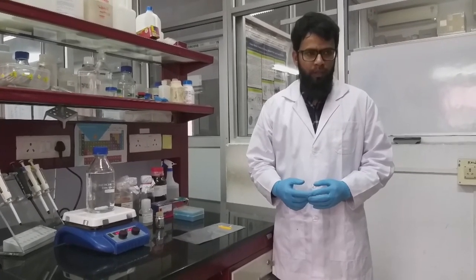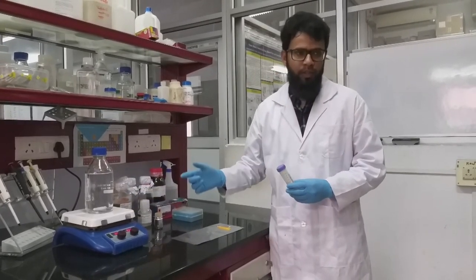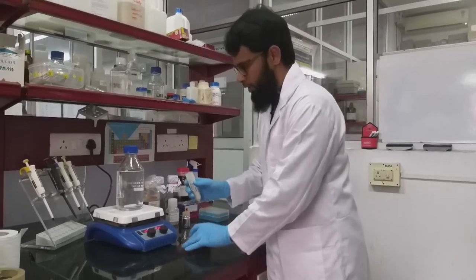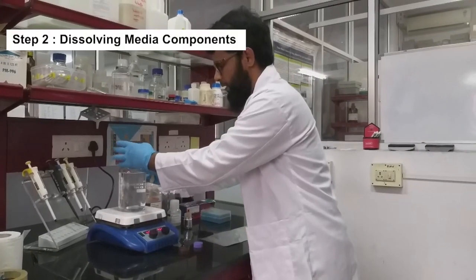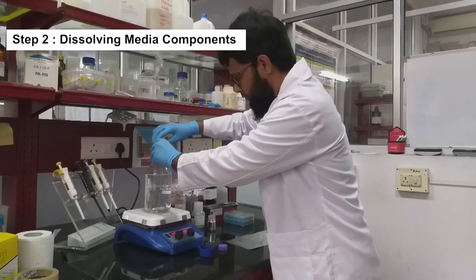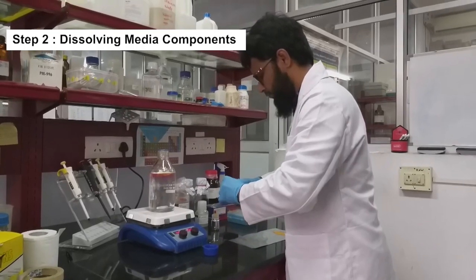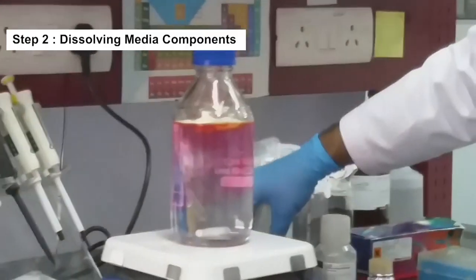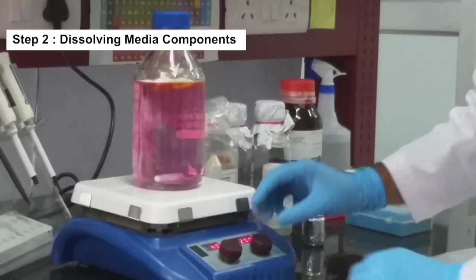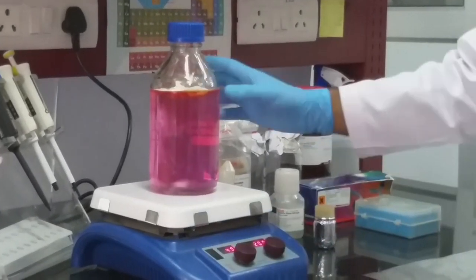In order to prepare media, now we will be adding the basal media to the already autoclaved double distilled water. We can use double distilled water or molecular water for that purpose. After adding media, we need to stir it on a magnetic stirrer for the components to dissolve completely.